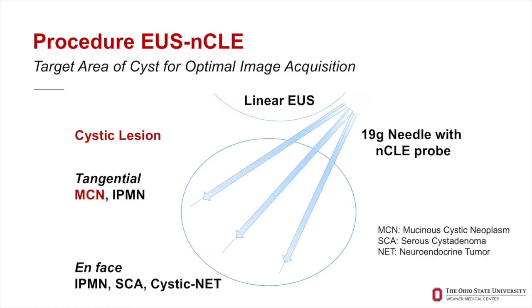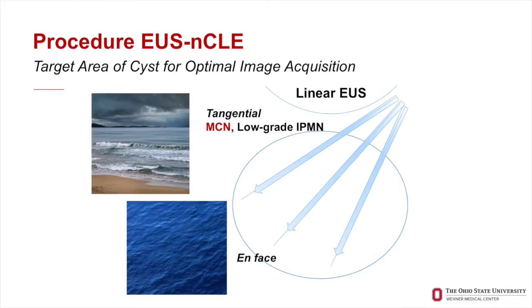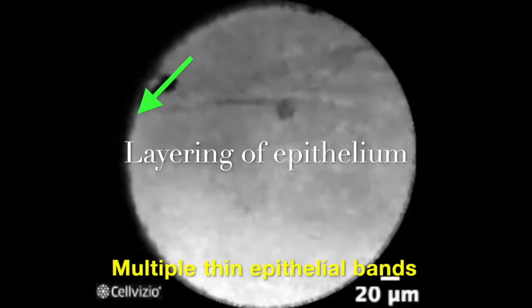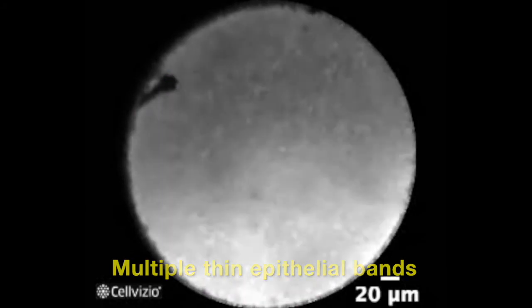What I briefly alluded to earlier in the talk, that the needle positioning does change the way the image is produced. When the needle is more tangential, you get the best images for MCN. The reason is that when you stand on a beach and look at the waves of the ocean, you see the waves much better when you are parallel rather than en face, where you hardly see any waves. In this video, you see multiple layers of thin, flat epithelium.